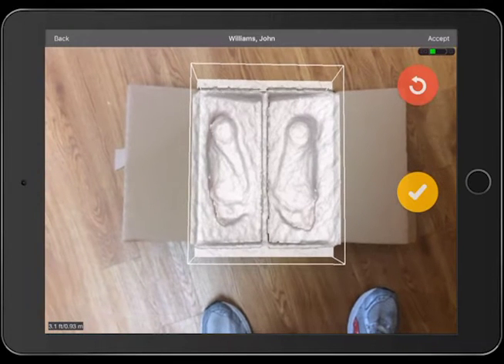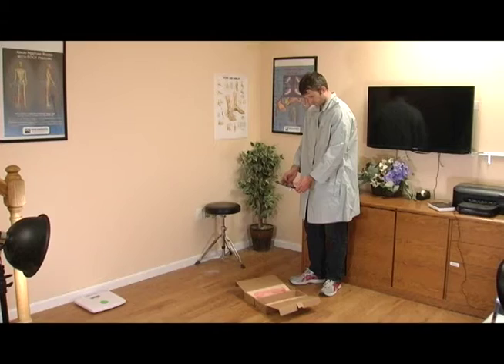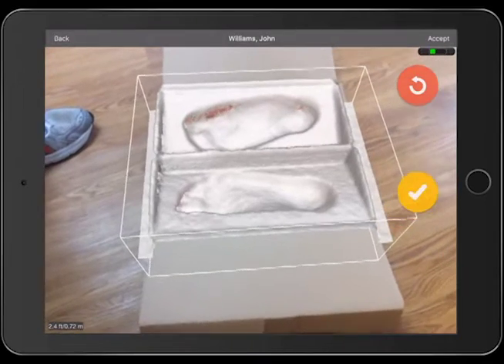The scanning surface will turn white while capturing the cast. You will see an alert at the bottom of the screen if you get too close or too far away from the scanning surface. Be sure to walk around the casting box and move the iPad around to capture all aspects of the casting walls.